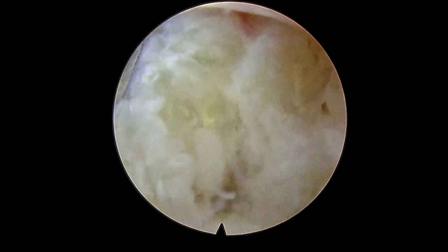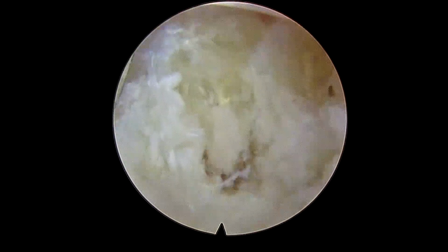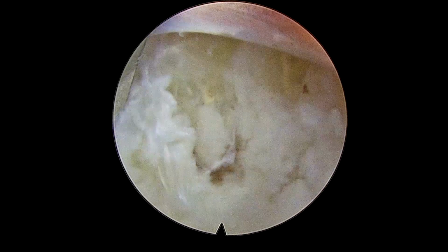In a young patient, the fragments keep coming from the disc space. So you have to stop somewhere. What I would suggest is, once you stop getting bigger fragments, stop going inside and stop removing the smaller fragments. These are some big fragments which are coming from the disc. Once the bigger fragments stop coming, I think we should stop.